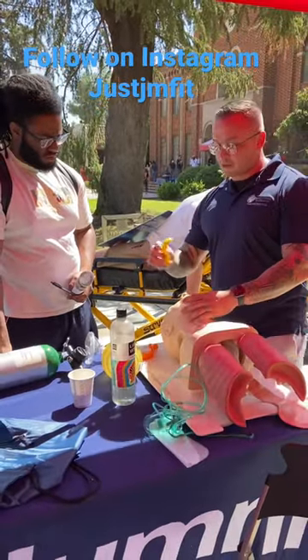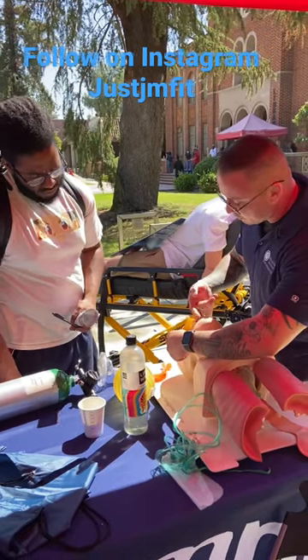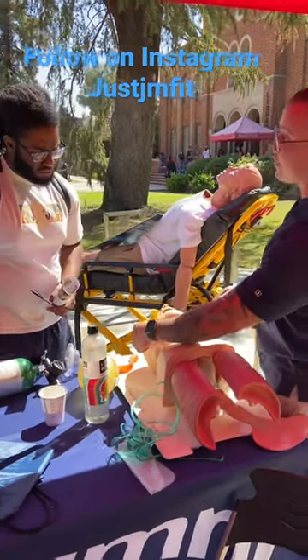And so the way this works, it's very simple. You measure from the angle of the jaw right here to the front of the teeth. So if it matches up like that, then it's going to fit.